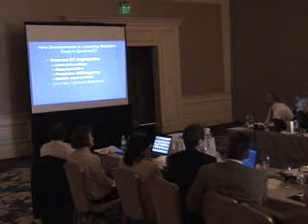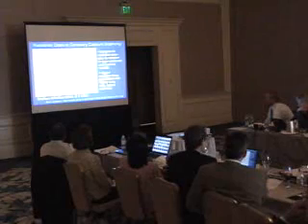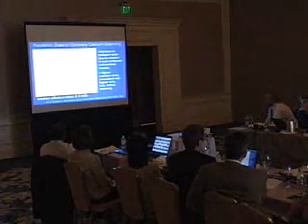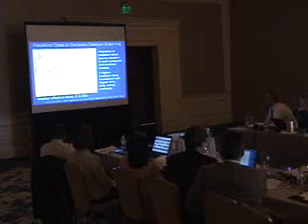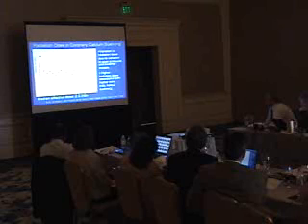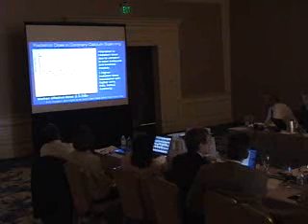Let's look at coronary calcium scanning. A similar thing is happening with coronary calcium scanning. It was looked at in a variety of different scanners, just to survey what was happening a couple of years ago, by the group at Columbia. They found that the average dose of coronary calcium scans at that time was 2.3 millisieverts. Again, we're less than background. It's a low radiation study, but it's getting even better.